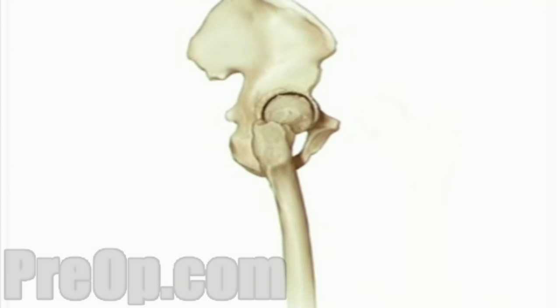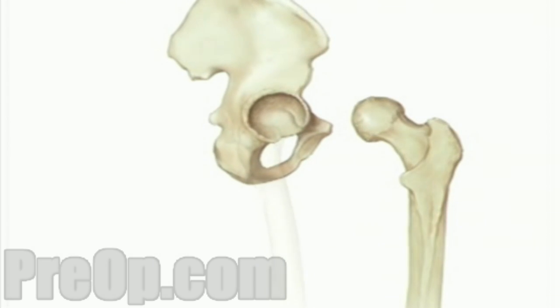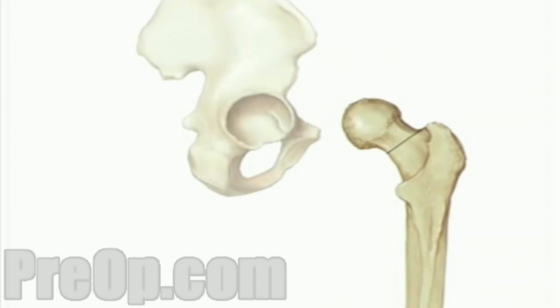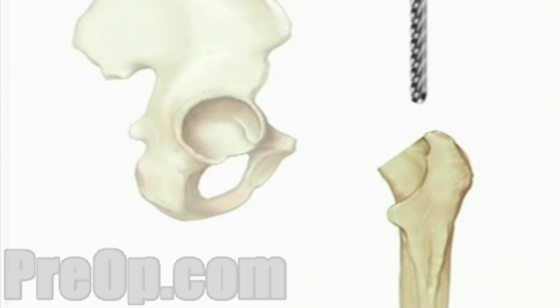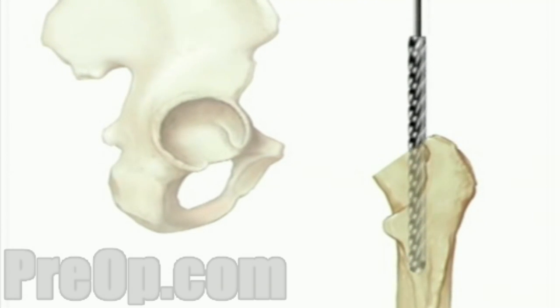Next, the team pulls the top of the thigh bone out of the hip socket. Using a precision surgical saw, your doctor will carefully remove the ball-shaped end of the thigh bone. Then, the surgical team will use a high-speed drill to hollow out the top of the thigh bone.